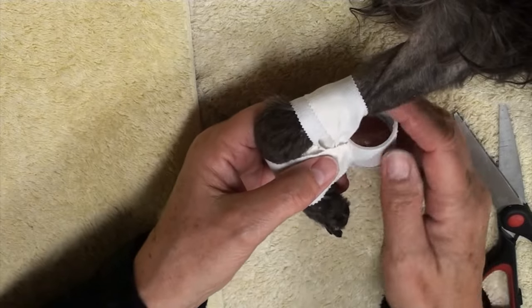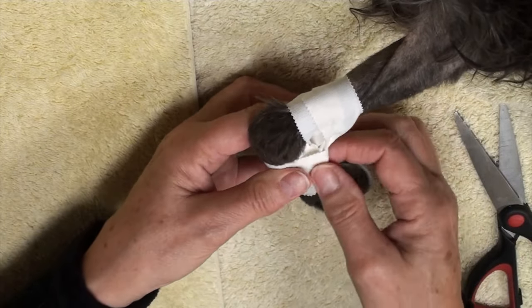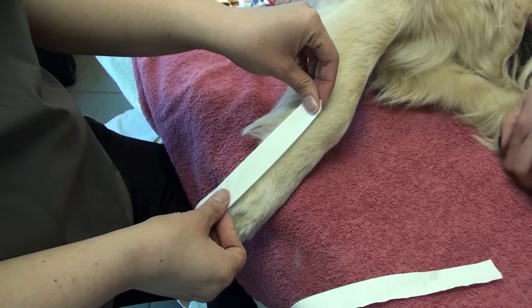Never make this tight. Our next patient is going to be a golden retriever, so a much bigger patient.